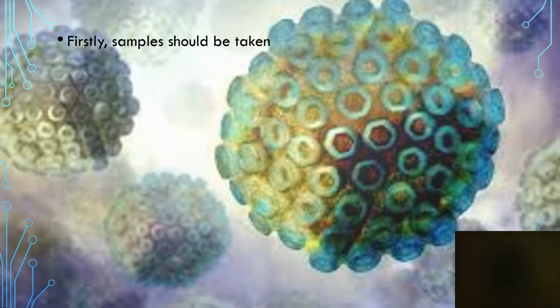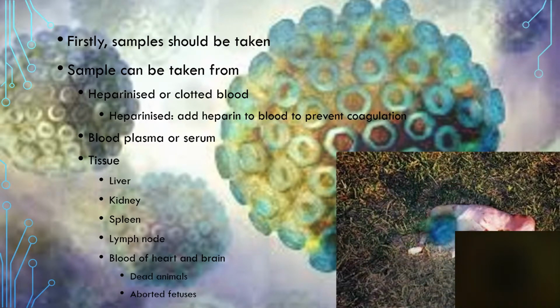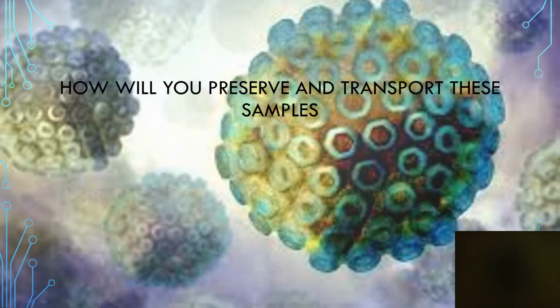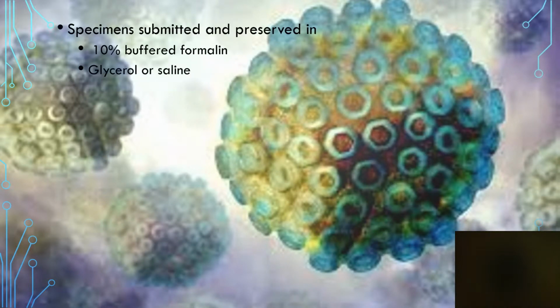The first step to take when trying to identify the Rift Valley fever virus is to collect some samples. These samples can be heparinized or clotted blood, blood plasma or serum, and tissue samples of the liver, kidney, spleen, lymph node, blood of the heart and brain from dead animals or aborted fetuses. Then these samples should be preserved and transported to the laboratory for further testing.